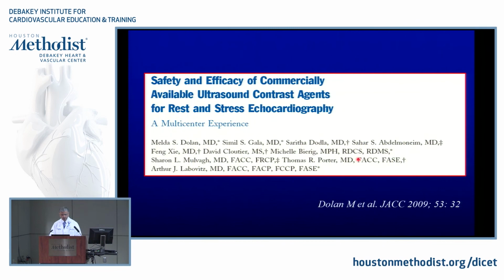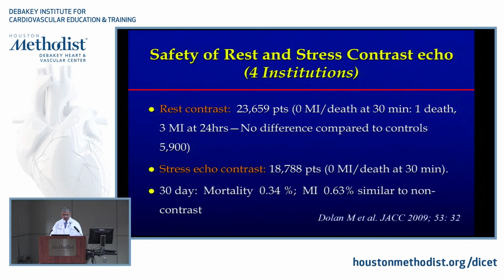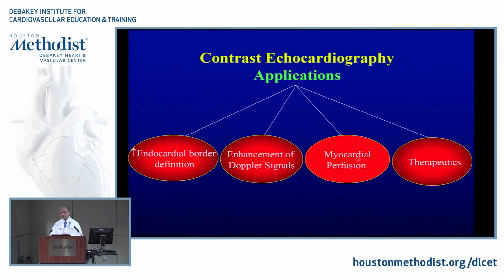This was from Dr. Dolan, who's actually now the works with industry. There are many studies, and early on in the early days, there was concern about safety of contrast and so many other things. So gradually, many of these black box warnings that were indicated for contrast, mostly for not using them in acute coronary syndromes, not using them with shunting, all of that is pretty much gone. And what is left is if you have allergy, basically, to the product itself, meaning that you have to have an exposure before, basically. So I'm going to stop here and ask any questions.